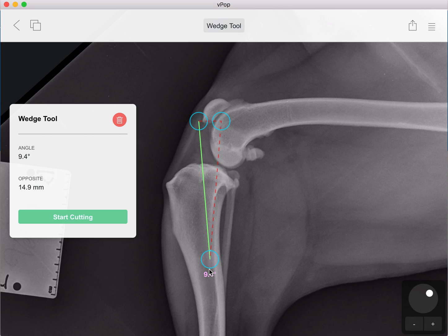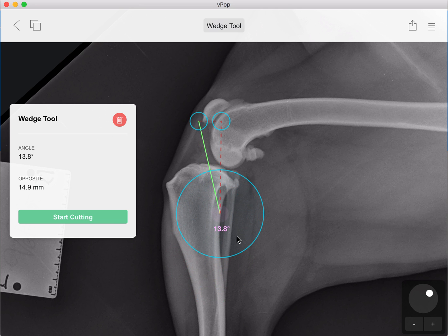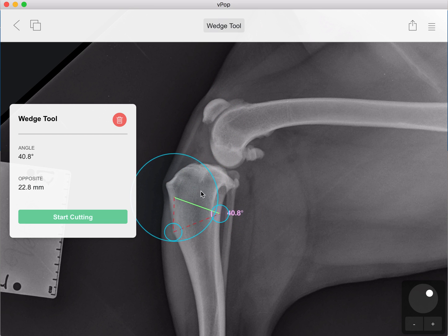To position first of all, we've got our three points. We can click on any of those in any order and drag them to where we need them to be. If you want to go into precision mode, just click on them once and they'll bring up the large circle — that allows you to move your cursor anywhere in that circle and control it without superimposing your cursor, or on an iPad or iPhone your finger, obscuring the end point. So we're in precision mode here and we'll move that apex to where we want it to be, then move the green line and the long dotted red line side to where we need them to be.